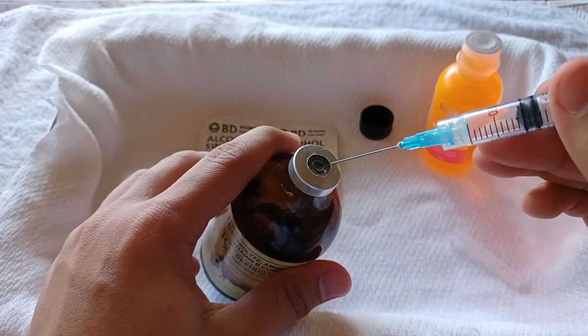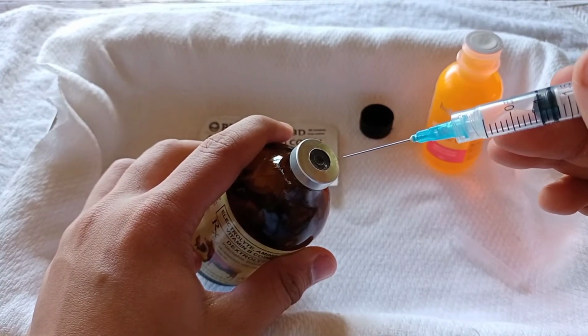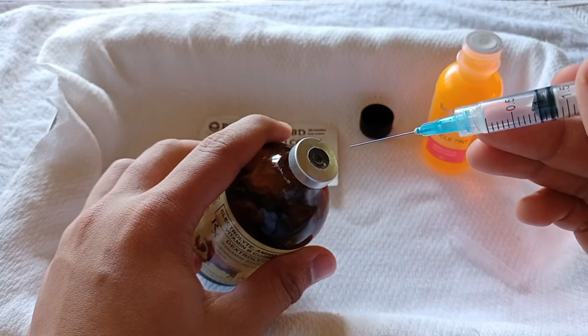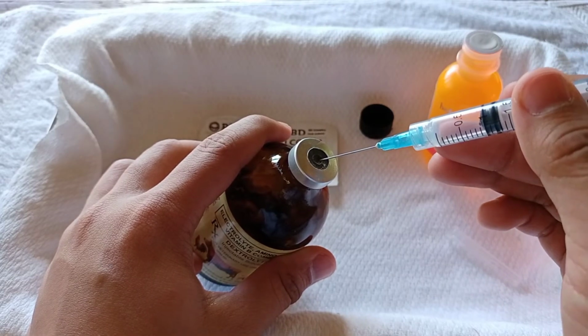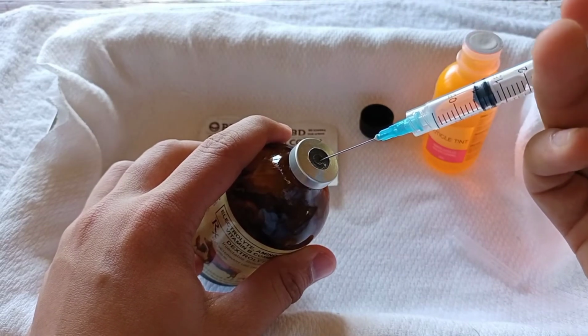Using a slanted angle, firmly insert the needle into the center of the rubber top of the vial, with the sharpest point of the needle, the tip, entering first.